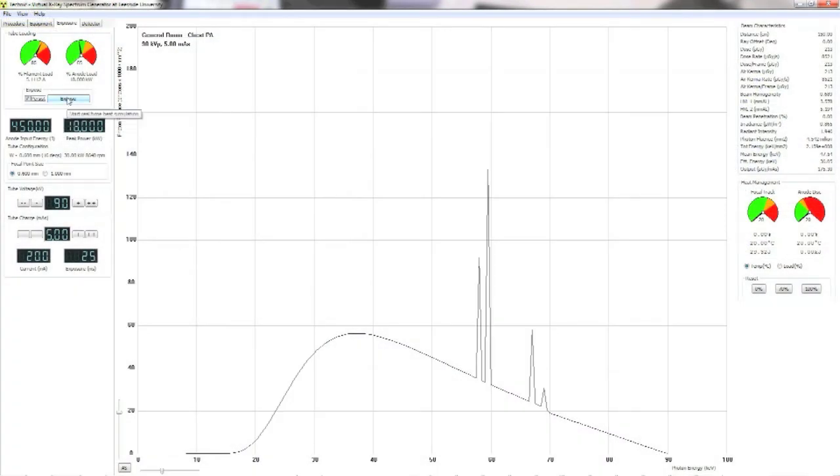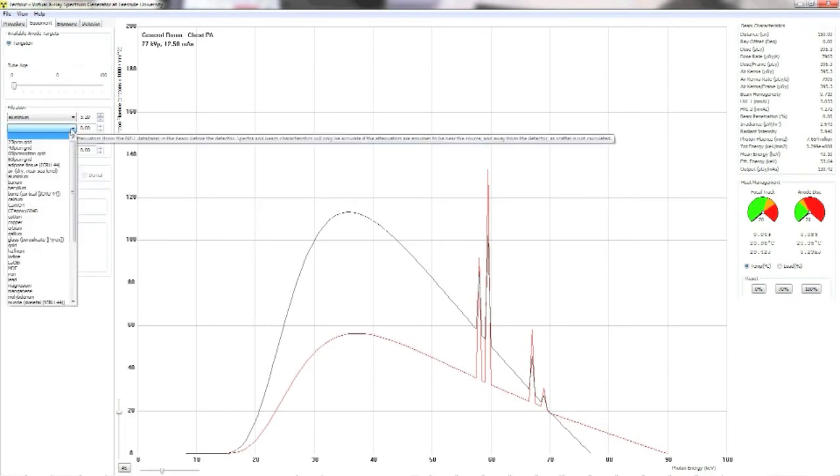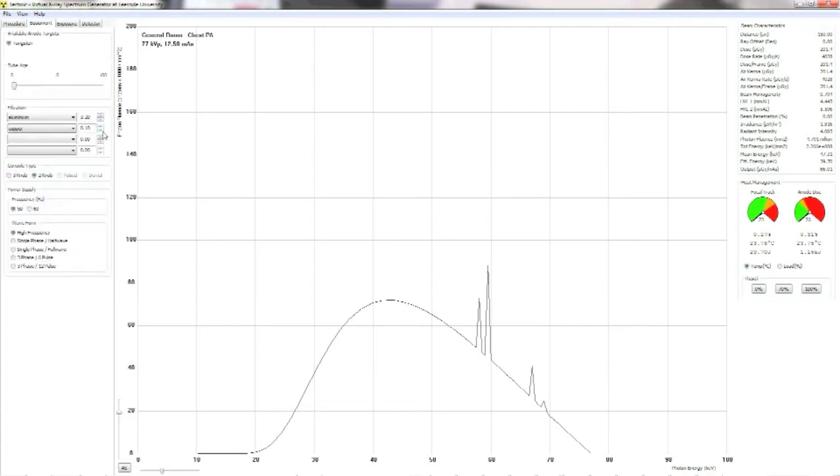A different group of radiography educators were struggling with the physics curriculum. There is a general feeling that students find it difficult to connect the textbook physics with the practical application of setting technical factors on the console, such as tube voltage and tube charge, more often called kVp and mAs. Dropping the physics isn't an option, especially as radiation dose has recently become a big issue, with some recent scandals involving radiographers and the new worldwide Image Gently campaign.